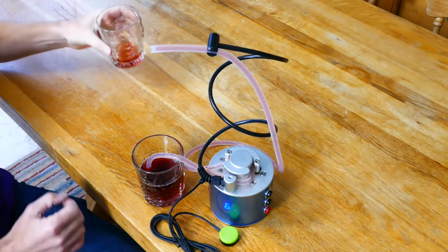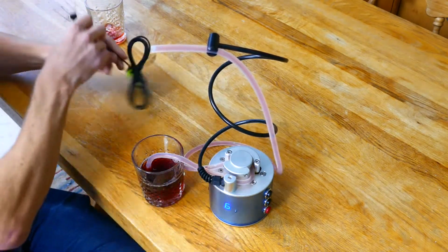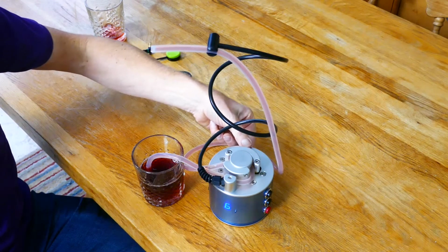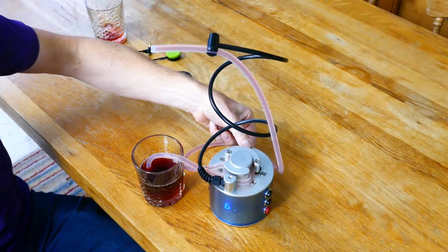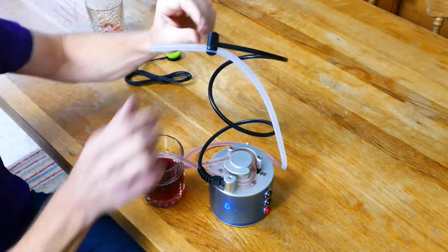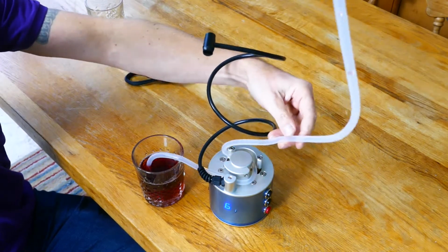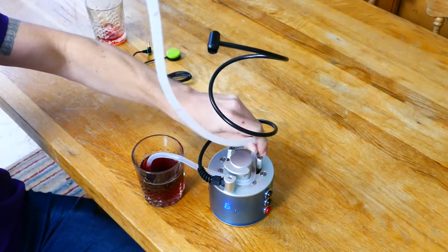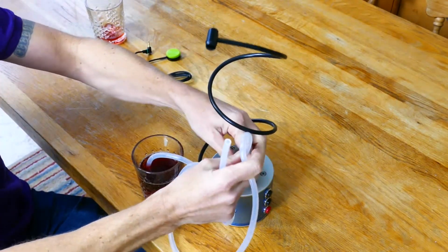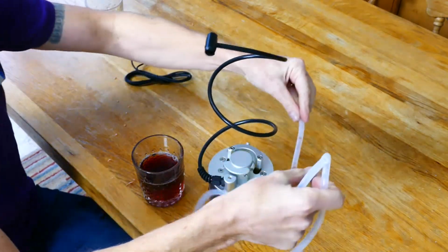To remove the straw from the drink once you've finished, first of all I'm going to unplug the switch, then I'm going to release the pump head with the lever on the back, and what you'll notice when I do this is that the drink runs down the straw. If I carefully lift the straw up now, you can even see the drink going all the way back down the straw into the glass, pulling it through carefully so I'm not pouring drink everywhere, just a little bit.